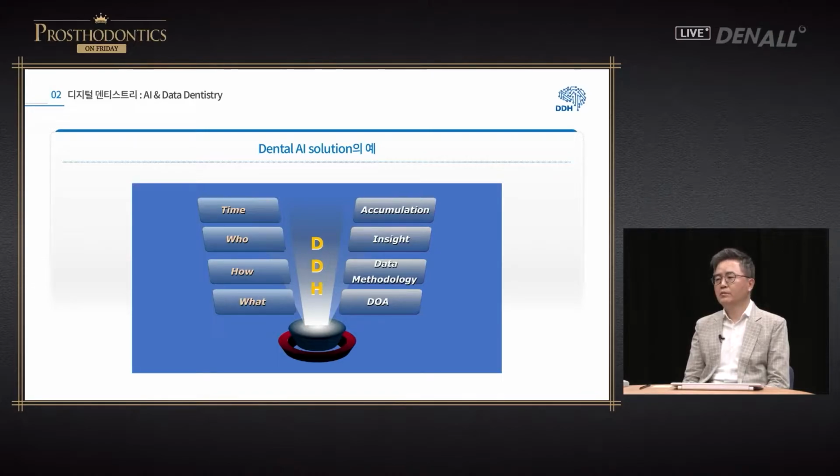If you just gather scan data, if you were a lab technician, how much of that would be meaningful to you? Unless you have a clear purpose of what to create, it's very meaningless. You need to have a clear goal. That leads to how. Clinical methodology needs to be defined in a very detailed manner, and following that, data curation and annotation needs to follow suit, and this will inevitably require a lot of trial and error and experience. This is very time-consuming. Finally, the matter of who does it also comes into the play.